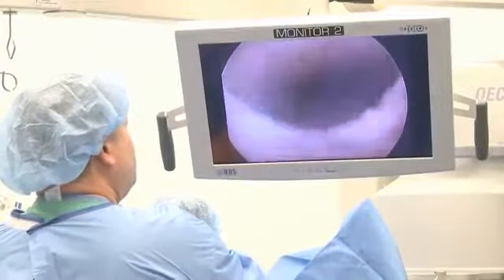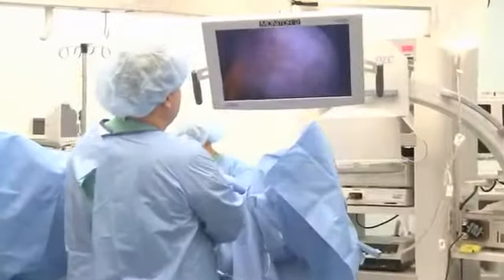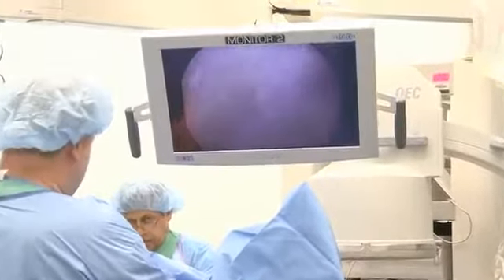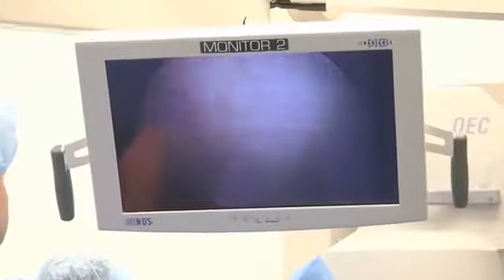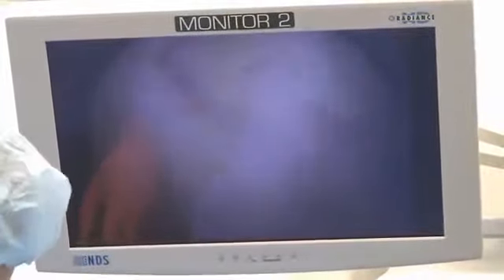So here's his urethra. There's a lot of kind of strictures in there. So we're looking to see if he has some sort of secondary malignancy in his bladder. We're trying to find a cause for his blood in his urine. He may have radiation cystitis. He's had previous radiation, and that blanched appearance of the bladder kind of looks like radiation cystitis a little bit.